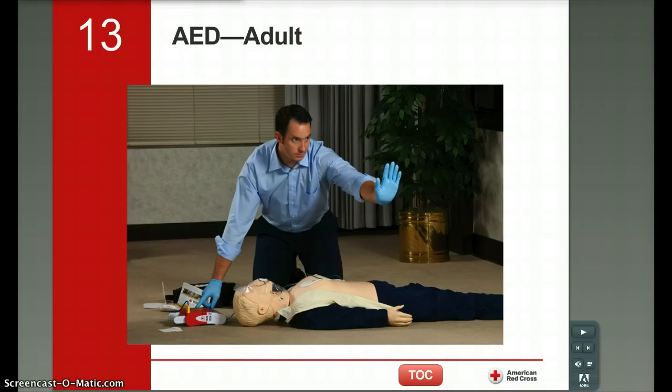And like we mentioned in some prior screencasts, we use an AED when we have a victim that is unconscious and not breathing. The way things are right now, many public places such as school buildings, government buildings, shopping malls, etc., many of these are equipped with AEDs. All of our high schools within our district have AEDs, and once again, these can be life-saving devices.